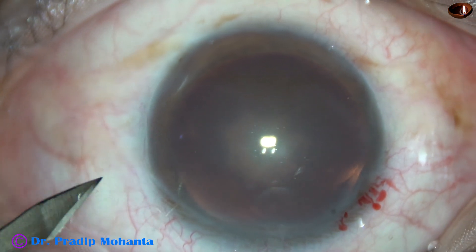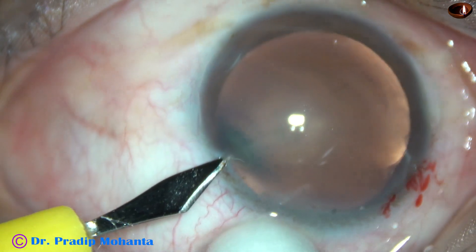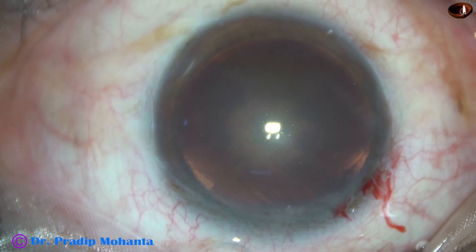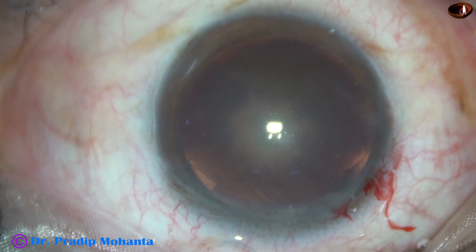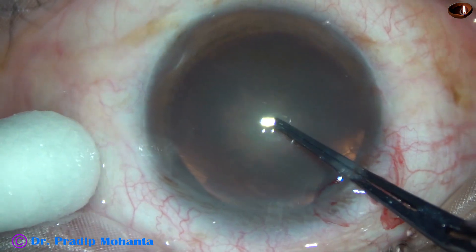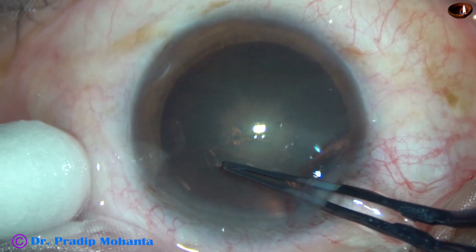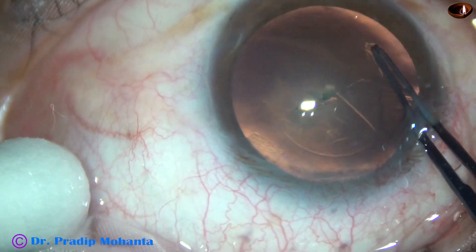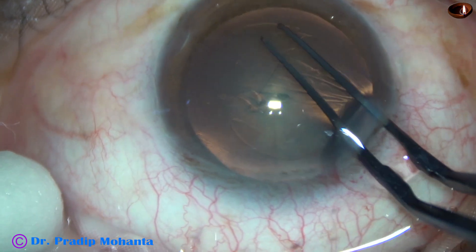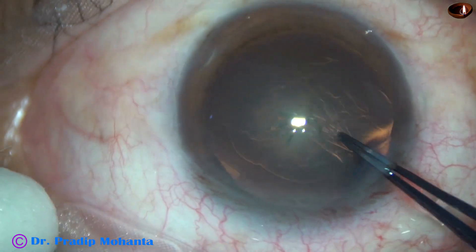A side port is made on the left side of the main incision, about 3 o'clock hours away. Now capsulorhexis is to be done. I am using a utrata forceps, piercing the anterior capsule at the center, raising a tag, guiding this capsular tag all around, and getting an adequate-sized rhexis of about 5.5 mm.